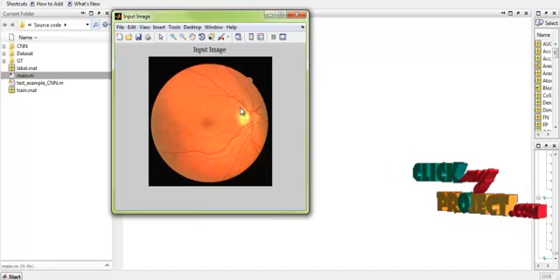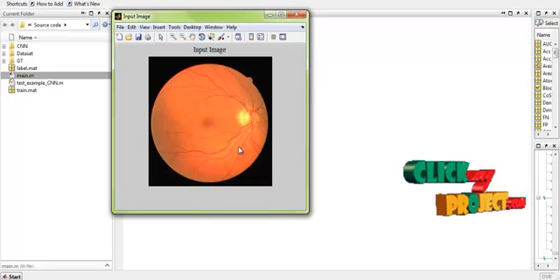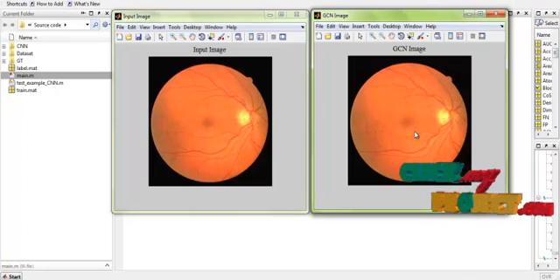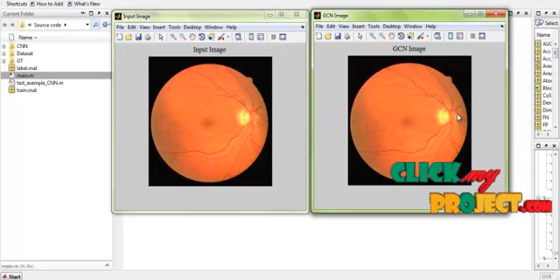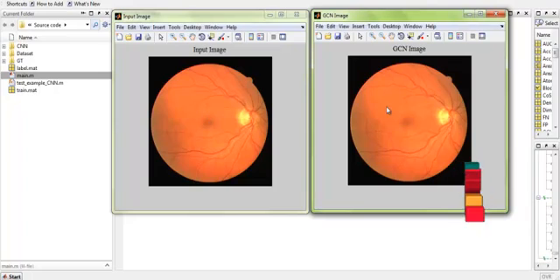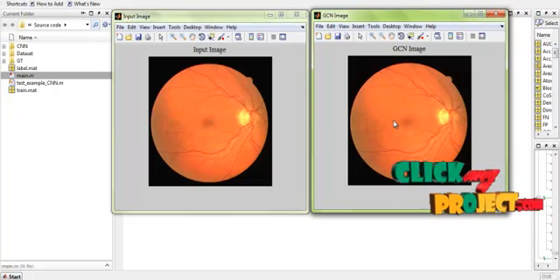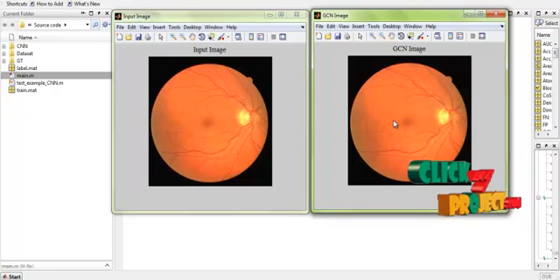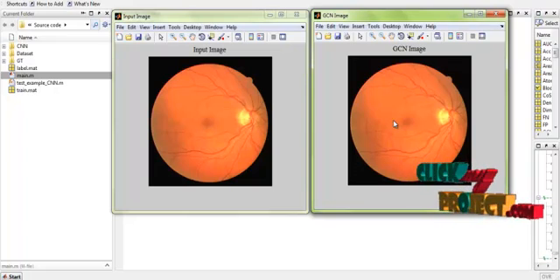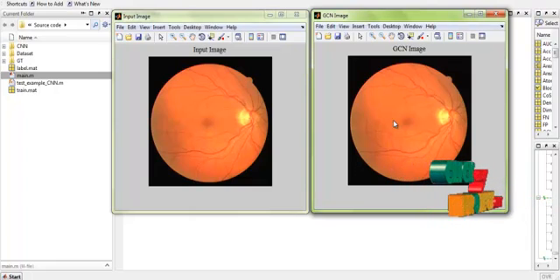We have to segment the blood vessel portions from the fundus image. This image is obtained after the global contrast normalization of the input image. As we can see, these two images are visually similar but the contrast of the overall image is normalized.